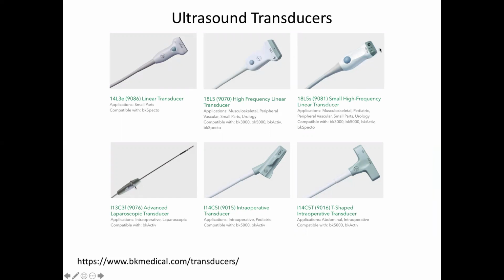For instance, this one is a high frequency one. So this is developed for making really high frequency ultrasound, but I didn't put one in here that's essentially a square, as opposed to a linear array where you make a slice and you tip the slice. You can also make a big square where you have independent elements on the transducer and focus the beam in 3D, right? So this one is cool.